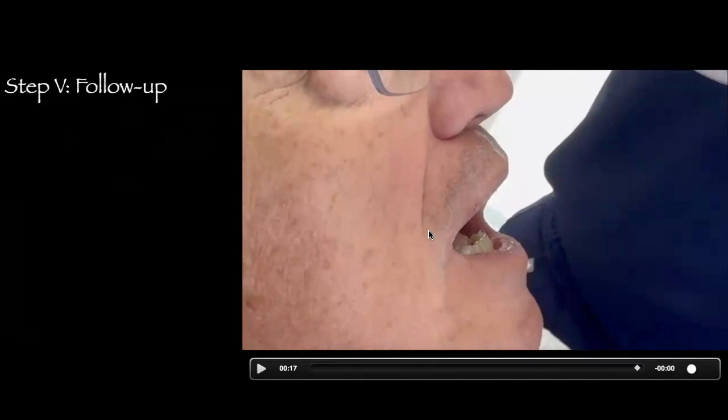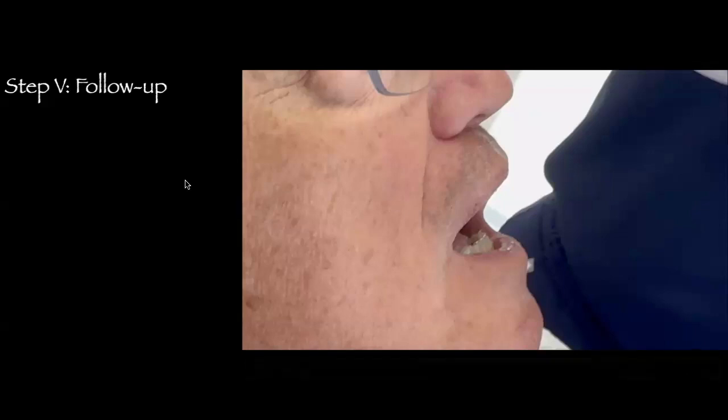I'm going to use it every 2 to 3 weeks to show the patient and to show myself how much intrusion and extrusion of the teeth we have accomplished. It normally takes 8 to 10 weeks, and it can sometimes take a little bit less or a little bit more. But it helps us calibrate where we're at and when we would be ready for the next step in this patient's journey to full mouth rehabilitation.